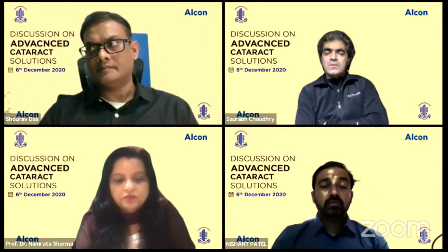Yeah, in the monovision concept, when you are trying to correct the multifocality, then the dominance is required. And also earlier when we were using the plus 2.5 and plus 3 and 3.5 different adds, mix and match category, in such situations the dominance checking is important. But in the modern setting, when you are going bilateral, trifocal or EDOF, I don't think that is required. Okay.